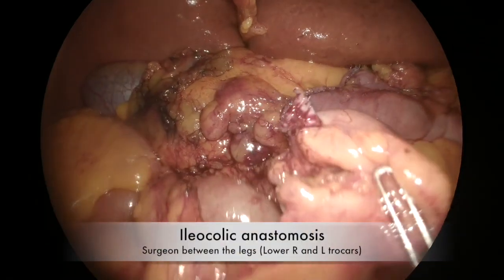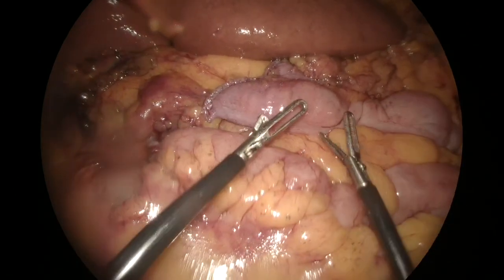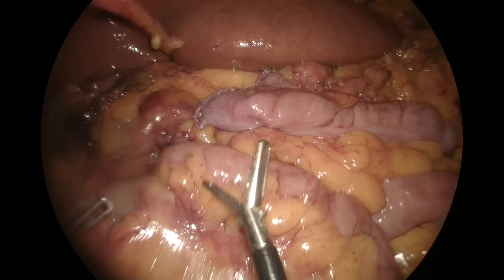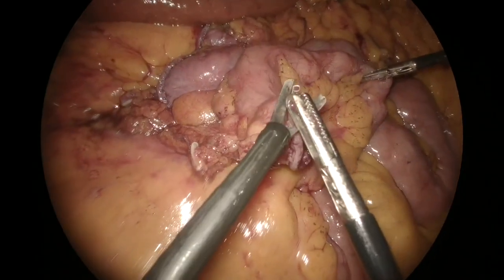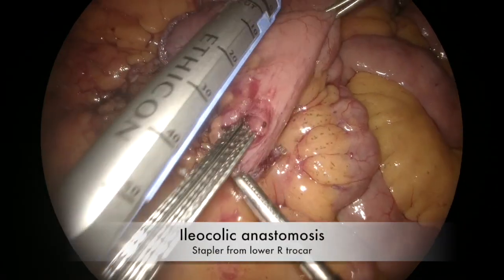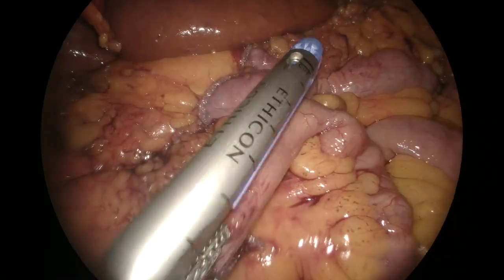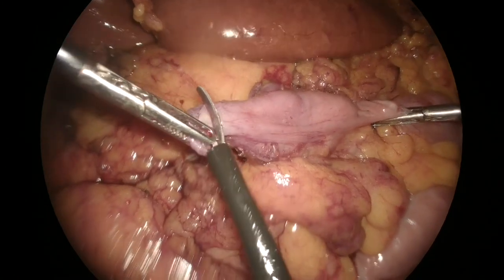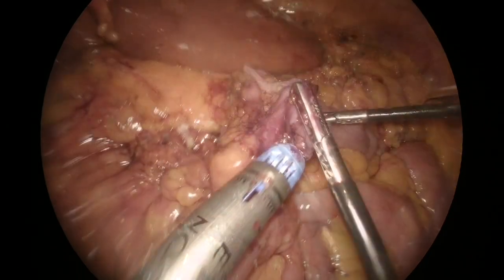After removal of the specimen through a protected suprapubic incision, the pneumoperitoneum was restored and the ileum and colon stumps approximated in an anti-peristaltic fashion without any traction. The medial end of both staple lines were excised and the linear stapler inserted through the enterotomies via the right lower trocar and fired. The surgeon was between the legs and the assistant on the left side of the patient.